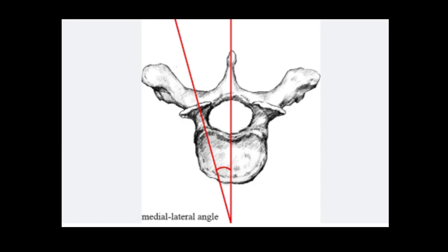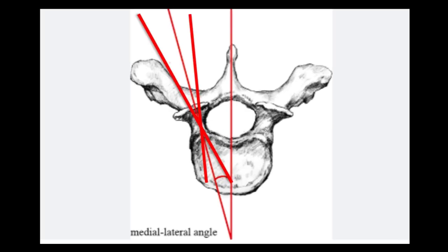So this is the mediolateral angulation of the axis of the pedicle. This varies depending on what level you are doing. You can actually pass pedicle screws along the axis of the pedicle, but there are also two more acceptable ways by which we can pass the pedicle screw.